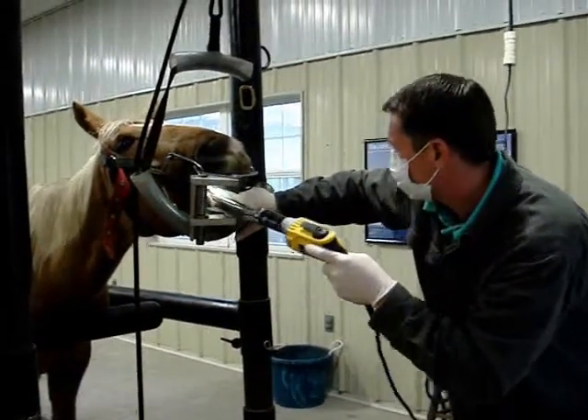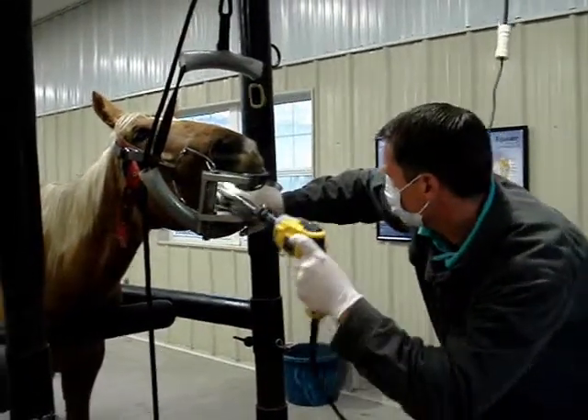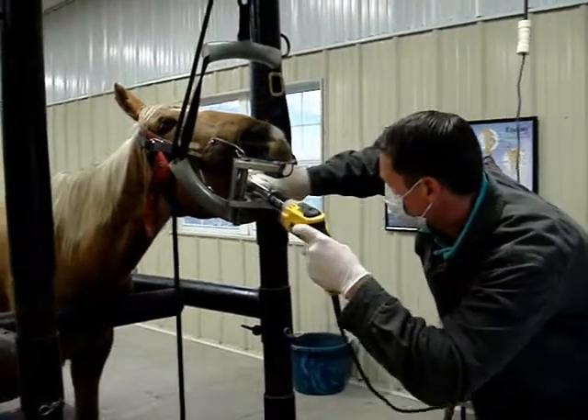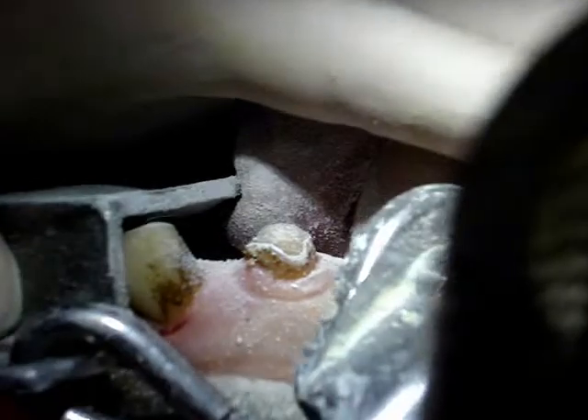All teeth are shaped, being careful to avoid disrupting the chewing surfaces of the teeth with the float. The table surface of the tooth is not touched unless the tooth is abnormally tall and needs to be made shorter. If the canine teeth are tall and sharp, they will be reduced in size. These teeth have no function other than for fighting and biting. The diamond bit is moved from tooth to tooth, being careful not to spend too much time on one tooth, which prevents excessive heat from building up on the teeth during this process.